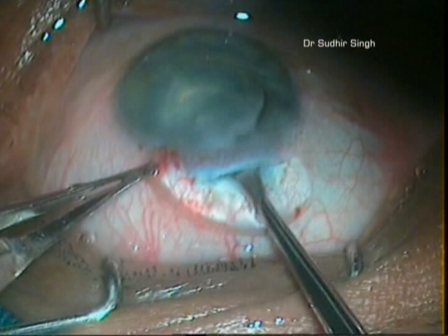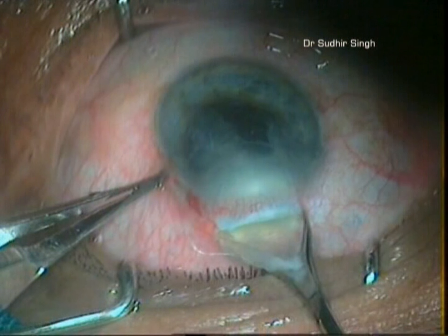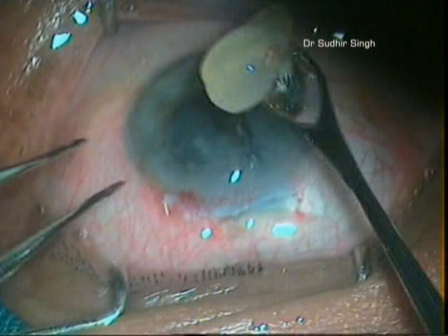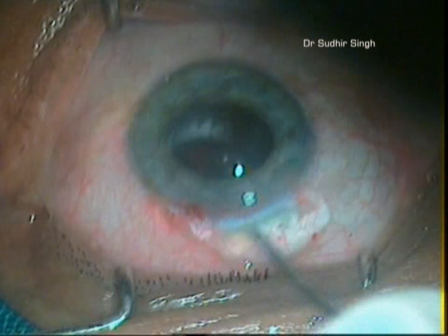The nucleus is engaged in the vectus and slowly withdrawn from the anterior chamber while the posterior lip of the tunnel is depressed. When the nucleus is engaged in the tunnel, the vectus is pulled posteriorly and upwards. This causes breaking and removal of a part of the nucleus, while the other part remains engaged in the tunnel.